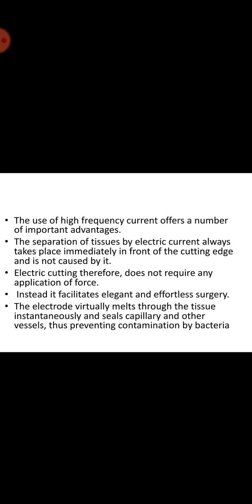The mixing of both these currents signifies one of the most important possibilities for use in electrosurgery. By blending the current of the tube and the spark generator, the degree of coagulation of wound edges may be chosen according to the requirements.